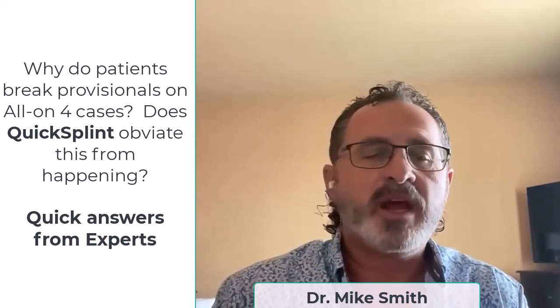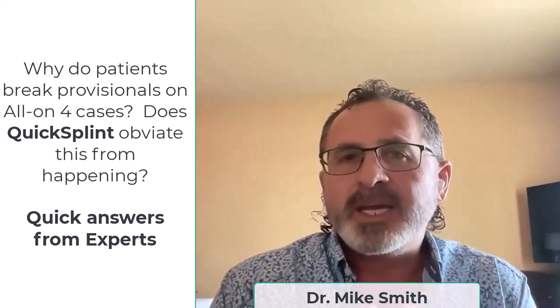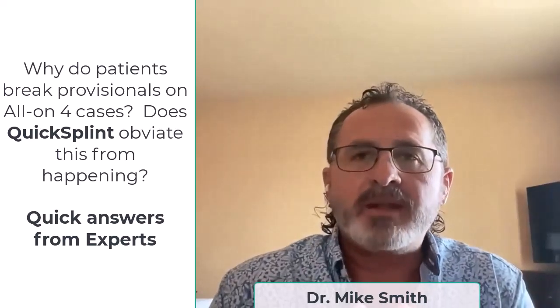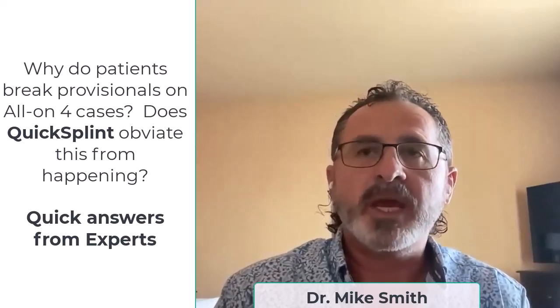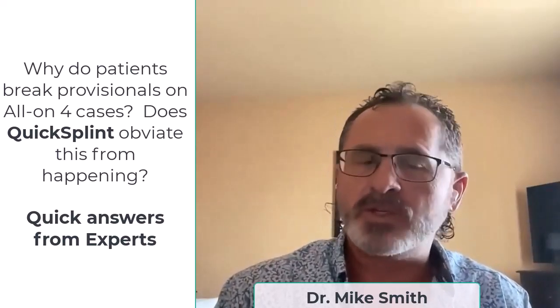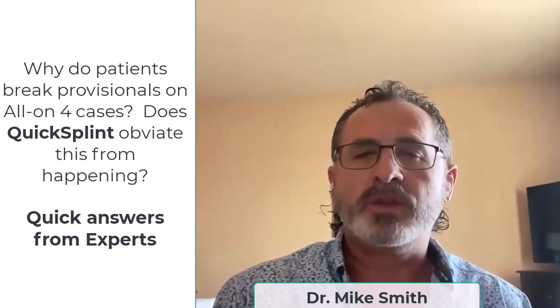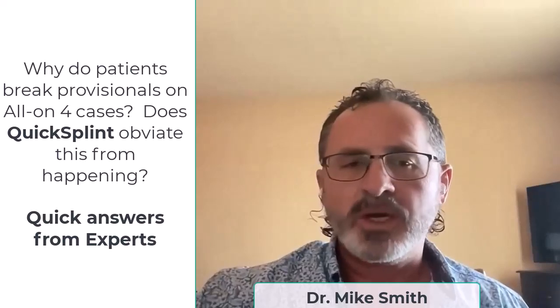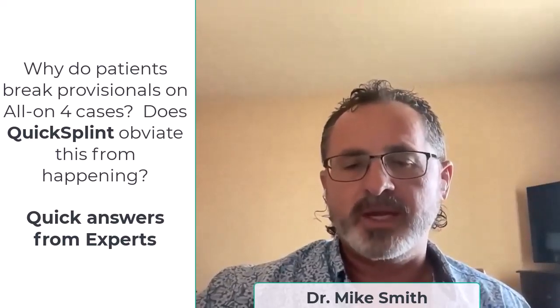The muscles haven't trained. There's no neural response. So what the QuickSplint does for us in these temporaries is it keeps them from having that smash, crash, bash that can break the temporaries because they don't know where their jaw is going to be. It also helps to mitigate the inflammation of the joint response because you've done a lot to change their occlusion to rebuild it with those temporaries on those implants. So it really helps to calm things down, keep the muscles under control, and keep the joint from getting inflamed.